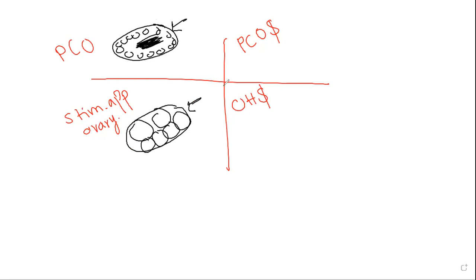What about the PCO syndrome? And here we have history of drugs, don't forget this, okay? All right. What about the PCO syndrome? Here we'd have the appearance by the ultrasound and clinical data, as in hirsutism, as in obesity, as in oligomenorrhea, and lab findings as well as in elevated androgens. Okay, 2 out of these 3 is sufficient to diagnose this. 2 out of these 3.